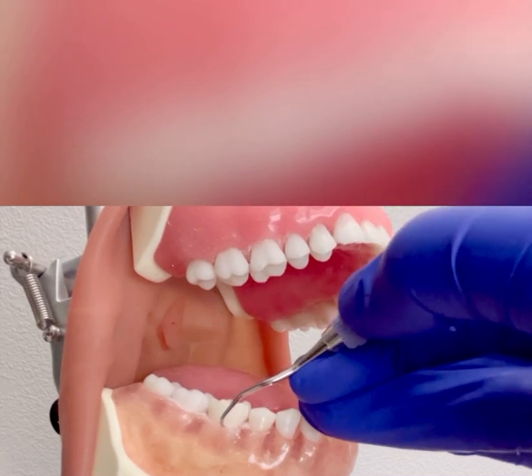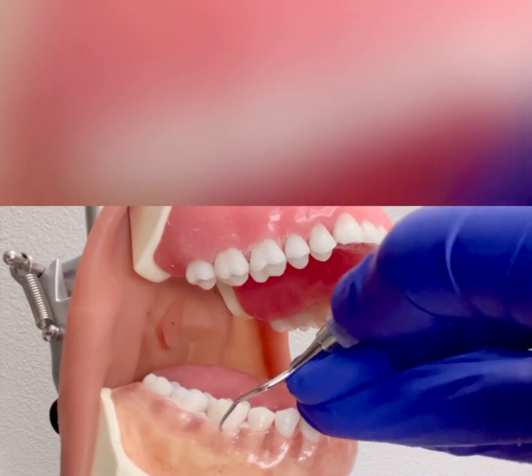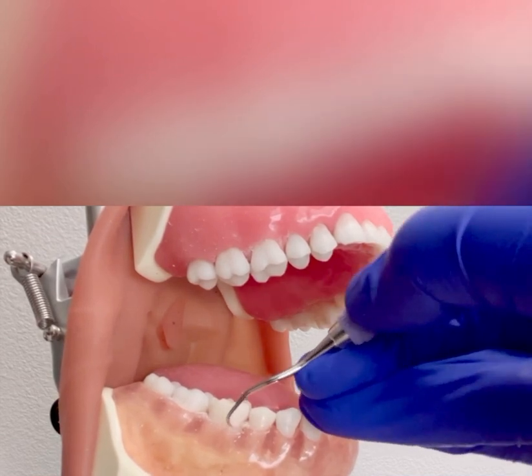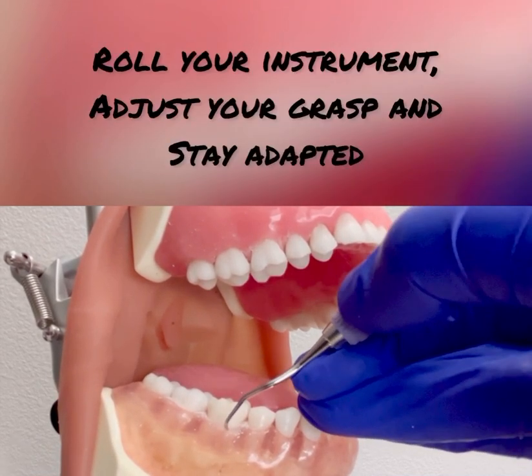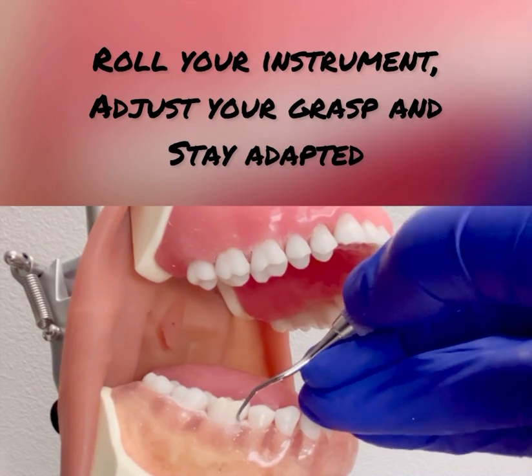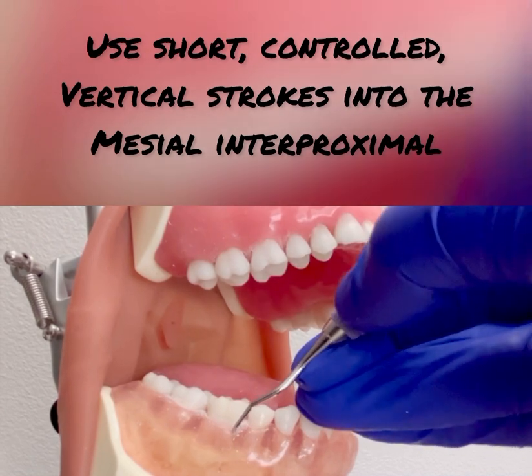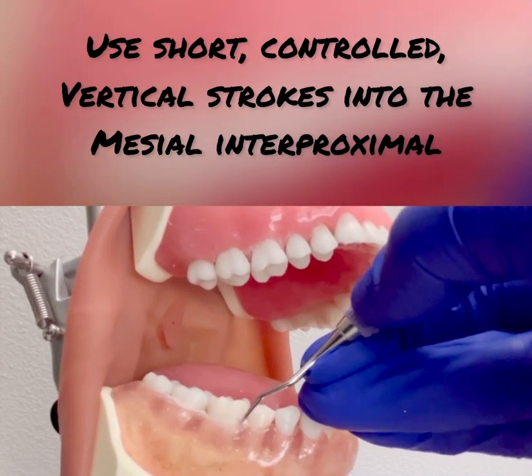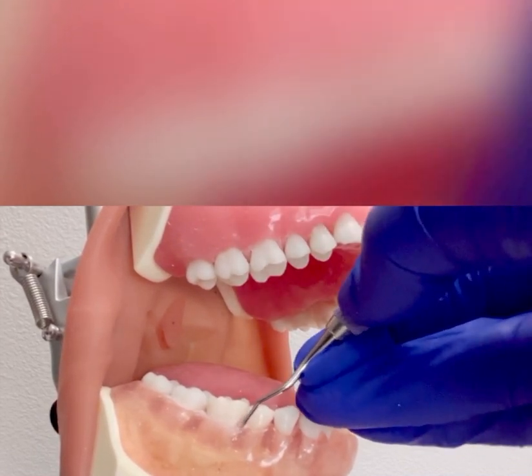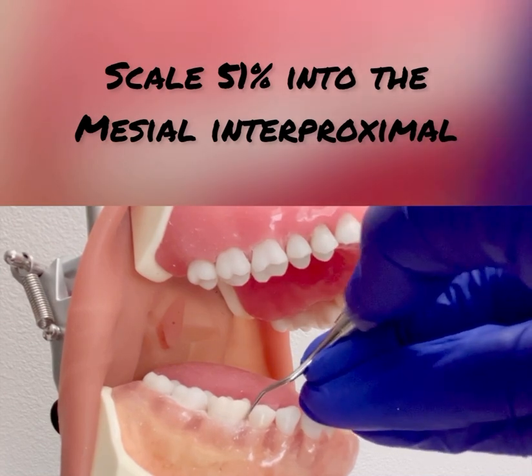Engage the toe third using moderate lateral pressure, overlapping strokes, working across the buccal surface. Once closer to the mesial line angle, roll the handle between the index and thumb, adjust the grasp, and continue with short, controlled, vertical strokes working into the mesial interproximal. Make sure to keep the terminal shank parallel to the tooth surface, going 51%, which is halfway into that mesial.